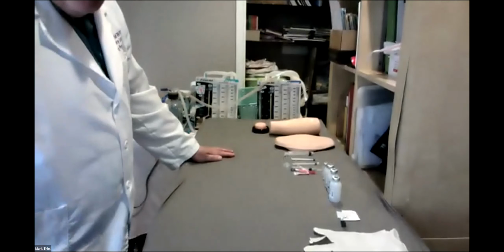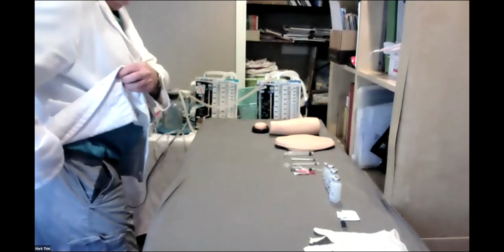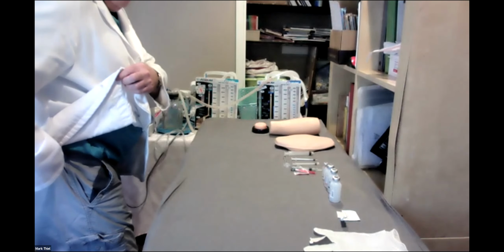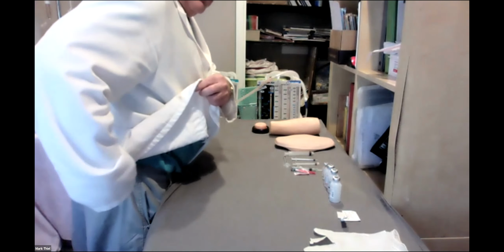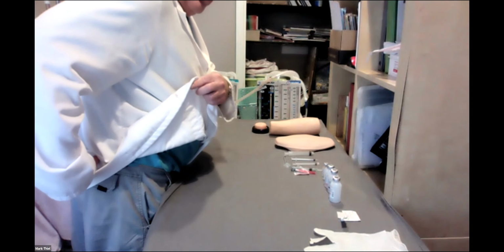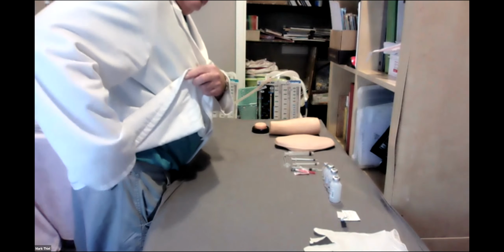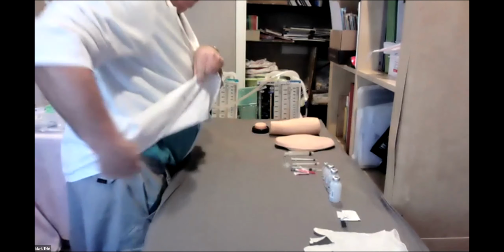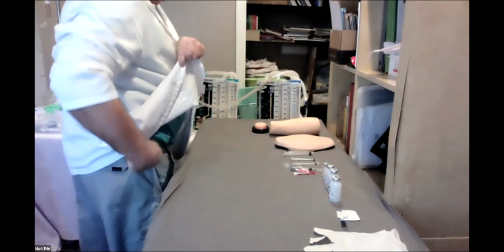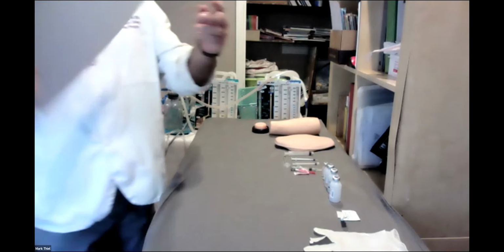We inject it, if you can see this, straight on the hip on this side, right? Not back here to the gluteus, the ventral gluteal. Right on the side of the hip.